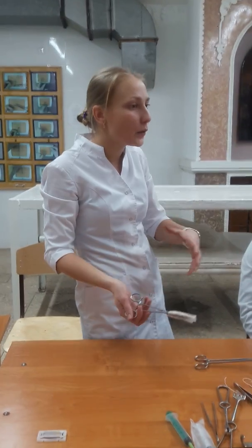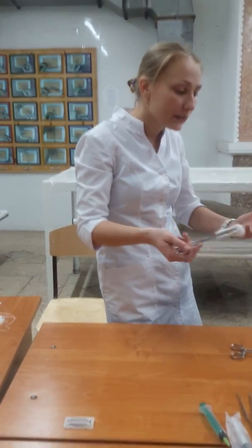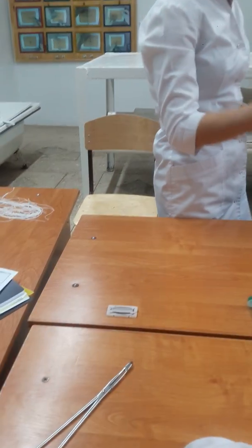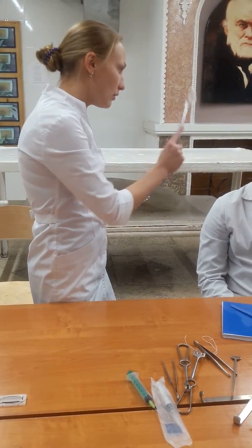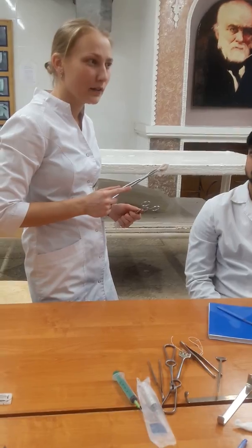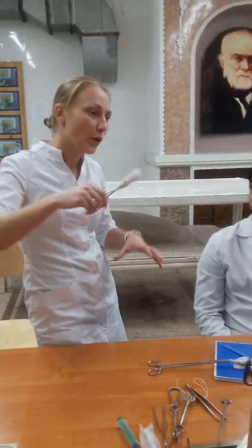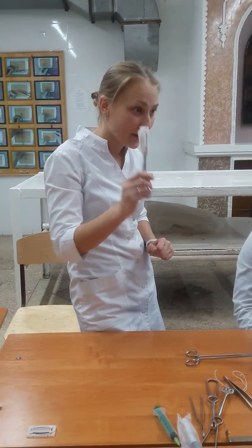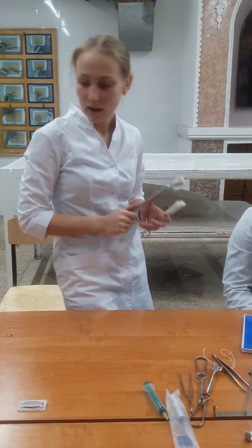Is there any liquid or blood in my wound? I can't see it because it's deep. This one is for the surface, for cleaning the skin, sometimes to wipe sweat from the forehead of the surgeon. And this one is for working inside the wound. This is a tupfer. This is a tampon. Tupfer, tampon.